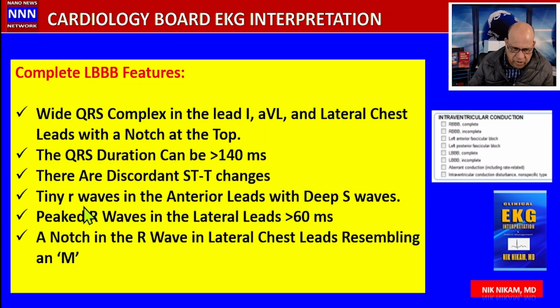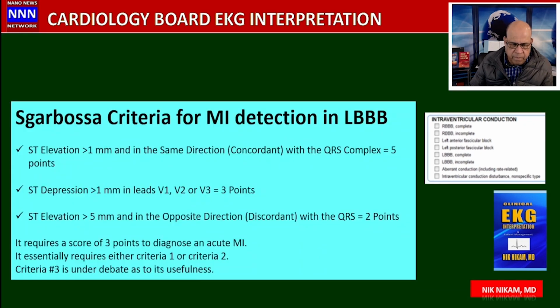So please remember this, it is important to find all these criteria. Can we diagnose myocardial infarction in a patient with a left bundle branch block?